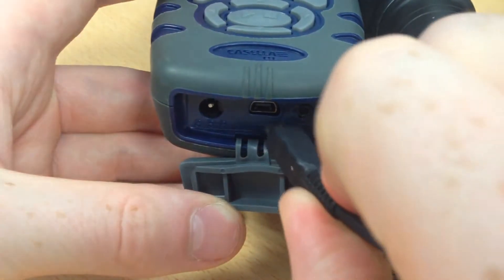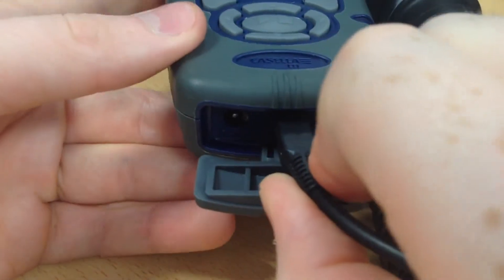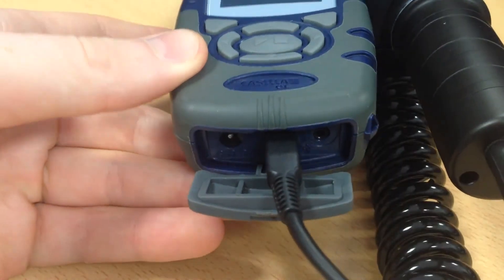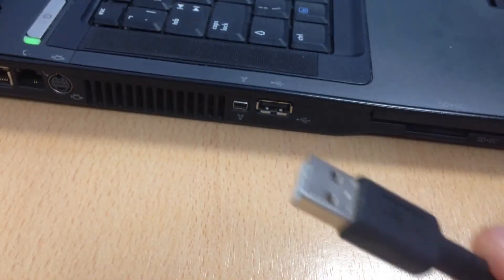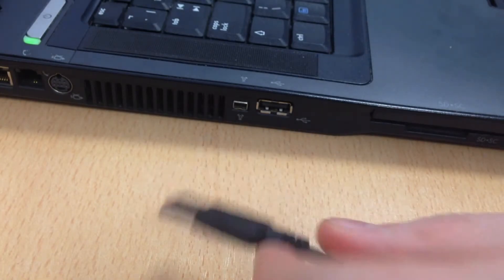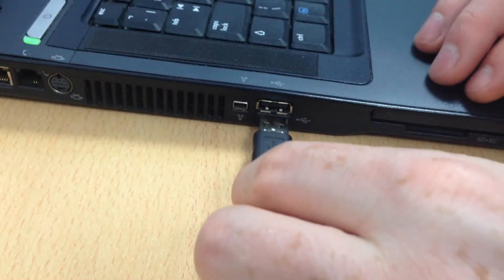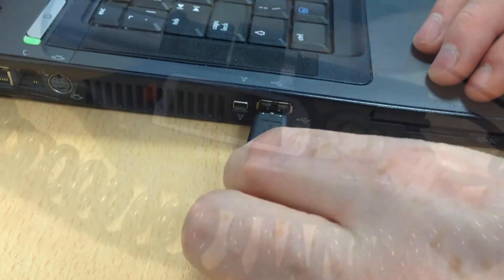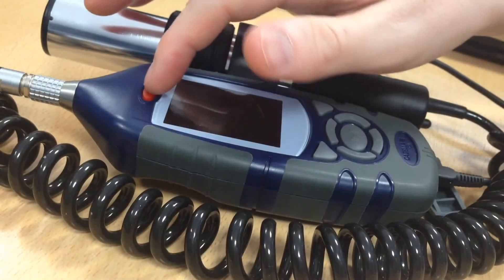Now plug the Mini B end of the USB cable into the bottom of your Casella MicroDice Pro. Plug the A end of the USB cable into an available USB slot on your computer and power on the Casella MicroDice Pro.